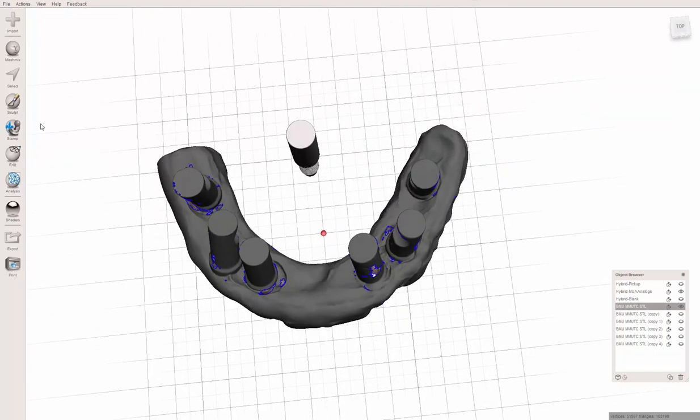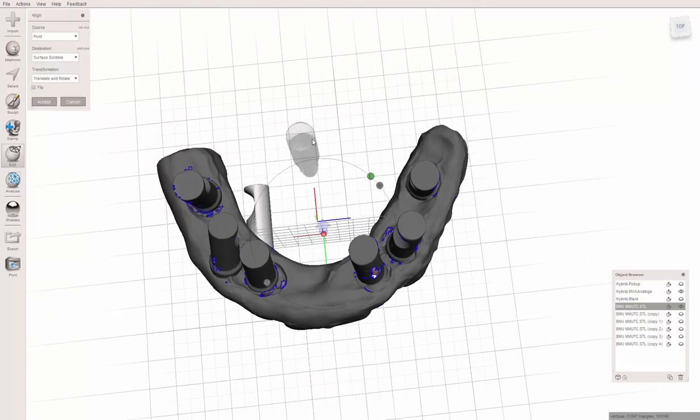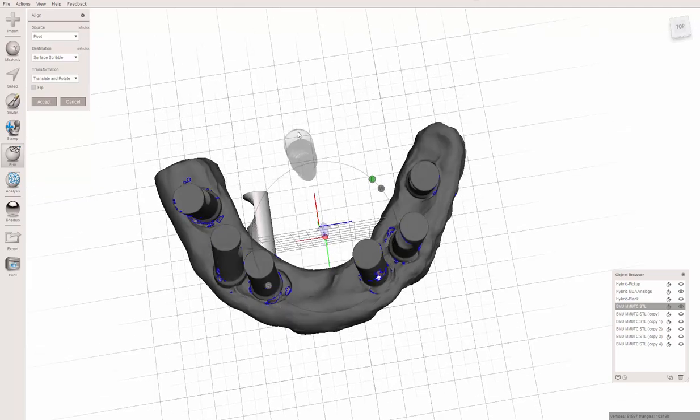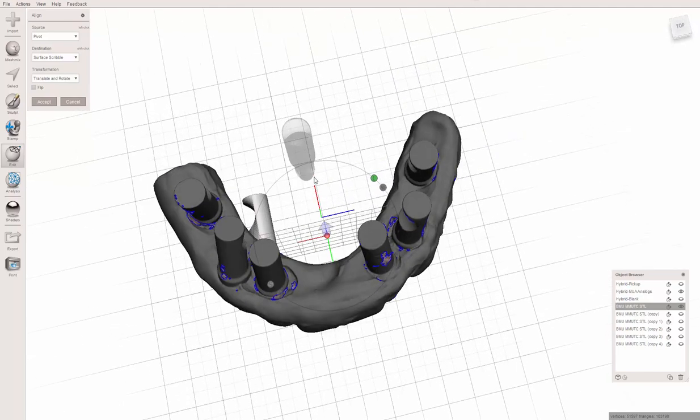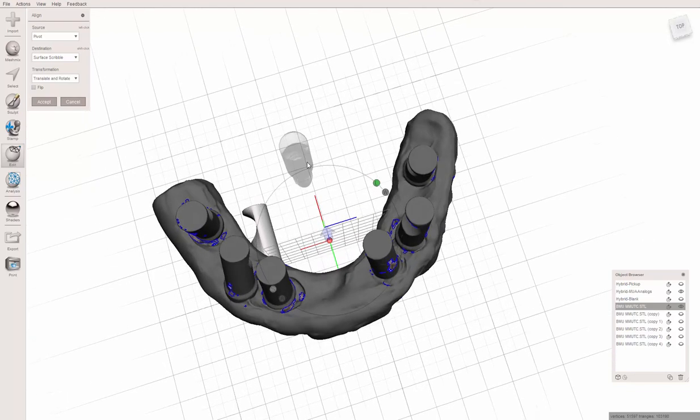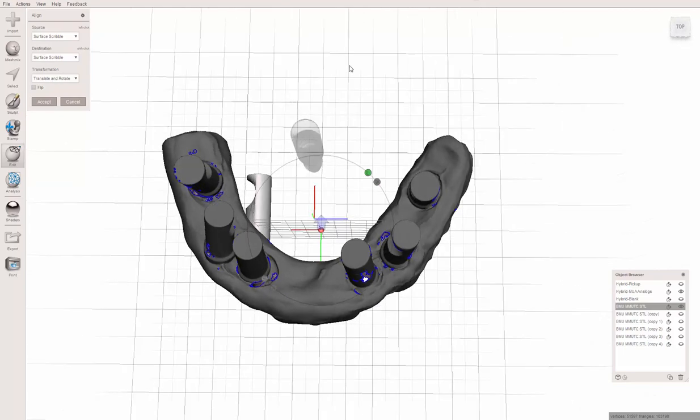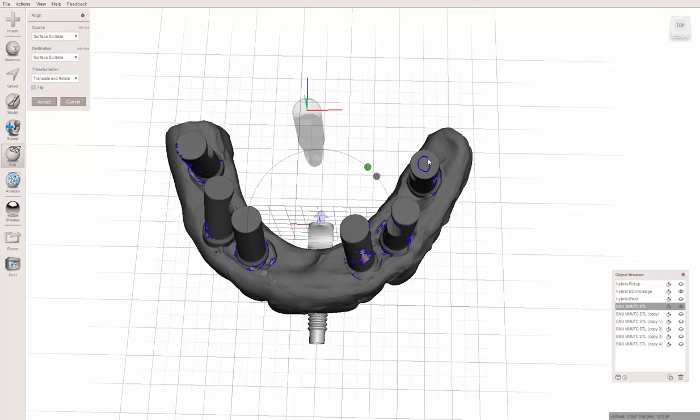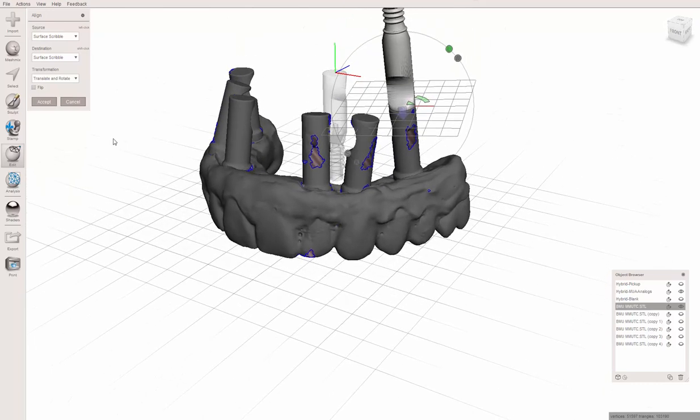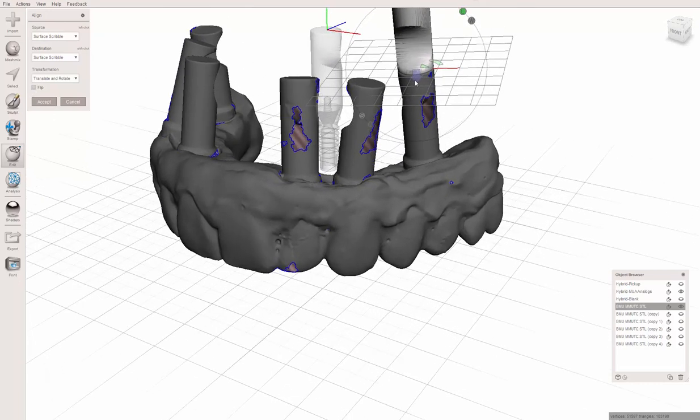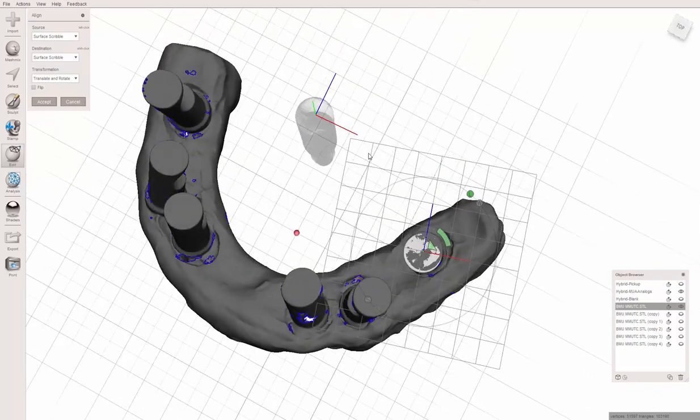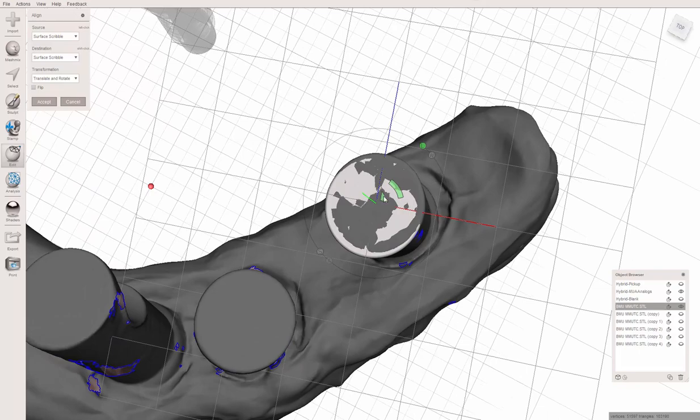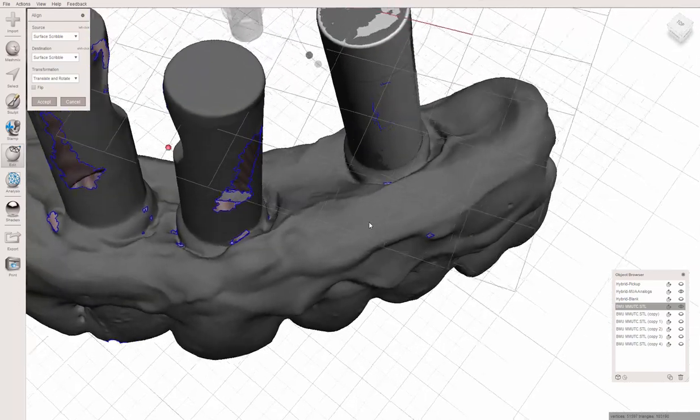Now to align this, I'm going to come over here to edit, align. I need to make sure it says surface scribble for source, surface scribble for destination, translate and rotate. Now if I draw a circle, make it pretty broad, and hold the shift button and draw a circle on the area that I want it to align to. It came in upside down, no big deal. Press the checkbox or the fat blue arrow and it flips over.